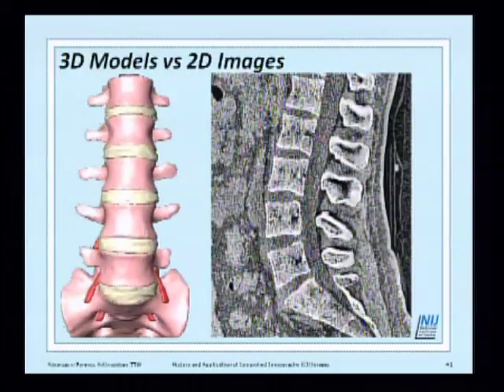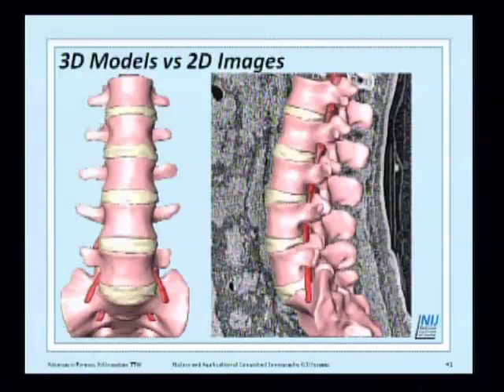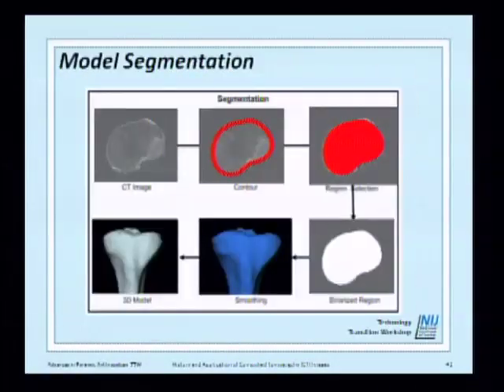Now, one of our initial applications still going on is to actually use it in segmentation. So this is a scan from our spine application. You can see the 3D models. This is a CT. Since the scan was done for the lumbar, it has a little bit poor quality because that's the effect of reducing the radiation on the patient. This is a live patient. So you can see here that we can actually have a very good, decent segmentation.